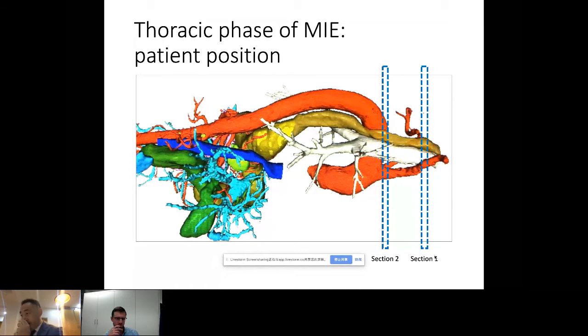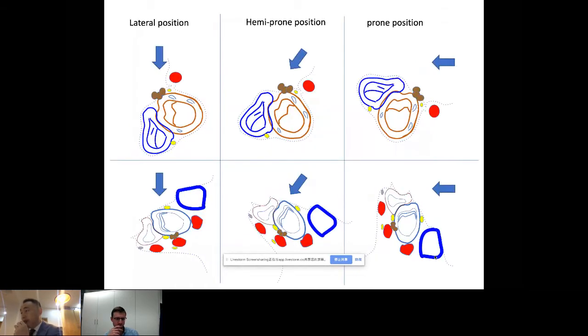If a lateral position is used, the surgeon's arms are almost at the same height as the shoulders. So the surgical instruments are almost vertically close to the mediastinum, and the comfort is low. When the prone position is utilized, the surgeon can sit to complete the operation. It is usually used by Japanese doctors. Moreover, any bleeding in the mediastinum can flow to the lower pleural cavity, and the surgical field would be very clean. But for this position, the anesthesia management and the intraoperative conversion would be very difficult.